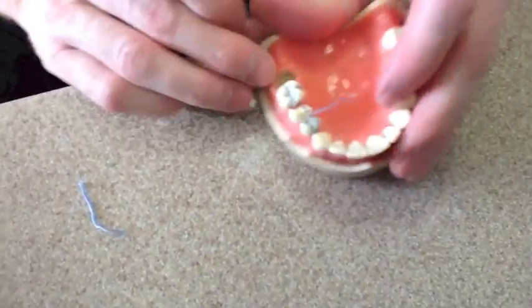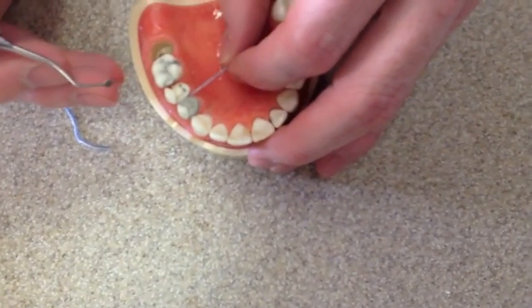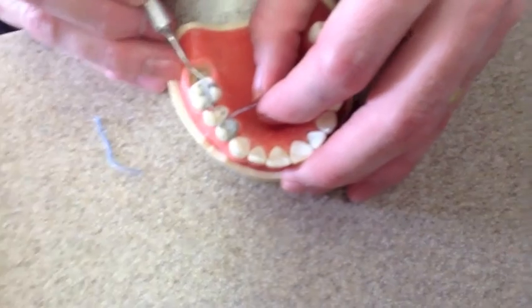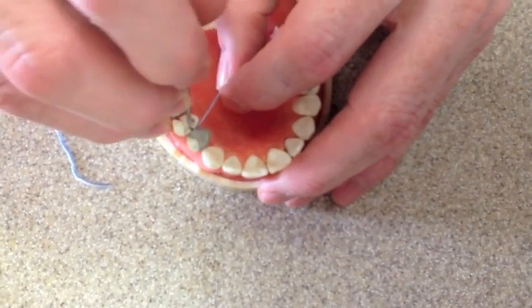Now, a little trick there. See if you can get over the top, you guys. A little trick is to pull that tight. See when it's loose, how thick it is? When I pull it tight, see how thin it gets? So as I pull it tight, it makes it easier to kind of push it down in there.